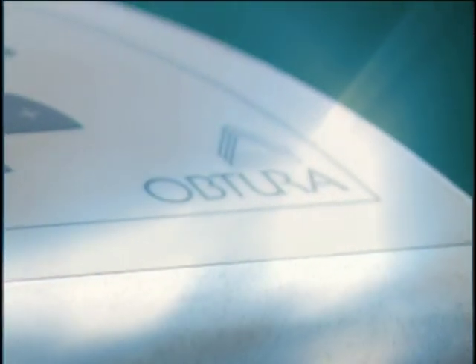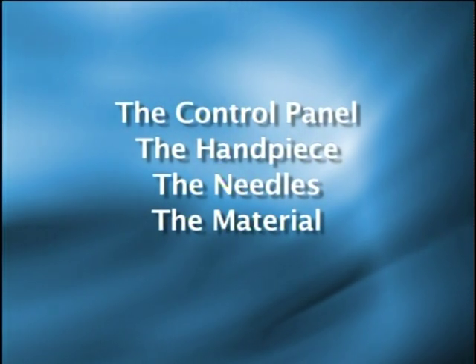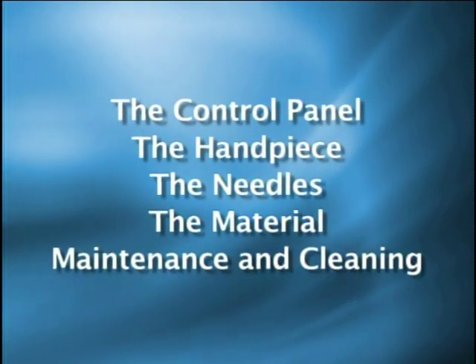This orientation DVD covers five key sections: the control panel source, the handpiece, the needles, the obturation material, and maintenance and cleaning.